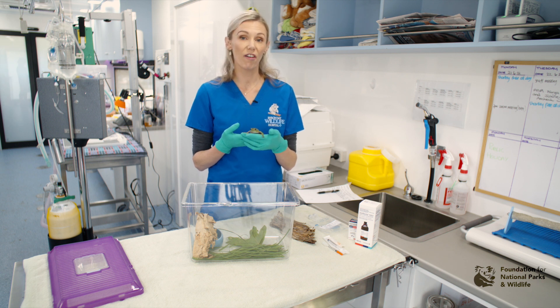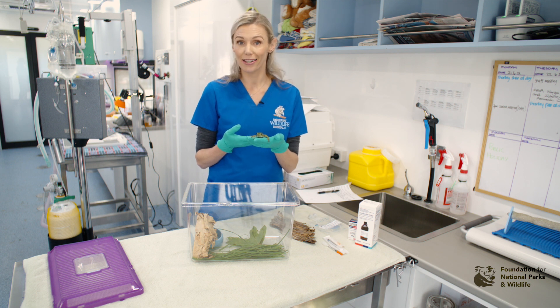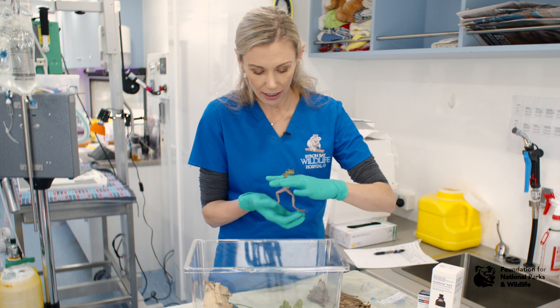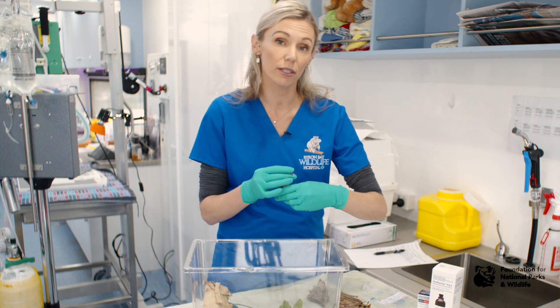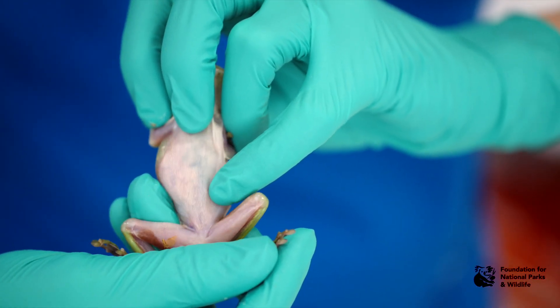To obtain a blood sample, the midline abdominal vein is going to be your easiest vein to access. You may require anaesthesia to obtain a blood sample in some frogs. The vein is located in the midline but can be quite small and difficult to get in some species. The vein is quite little but you'll see it as a faint blue line.